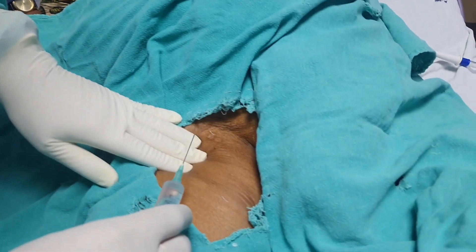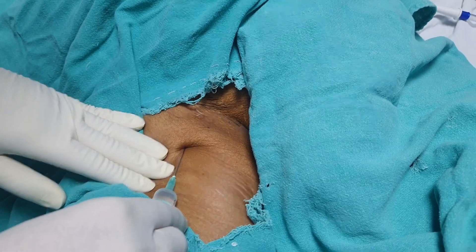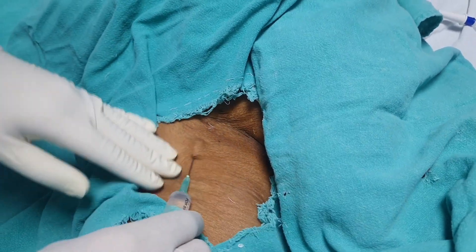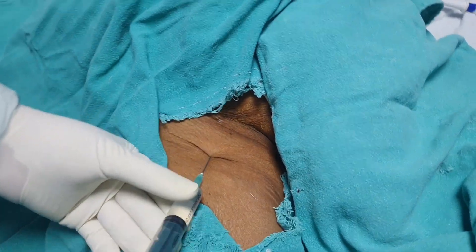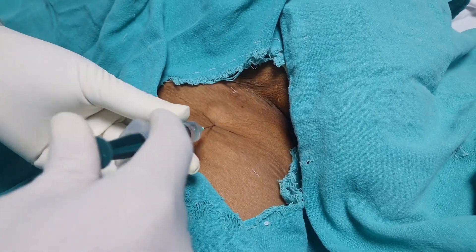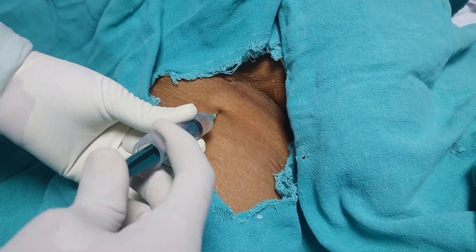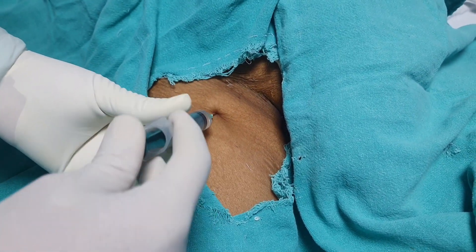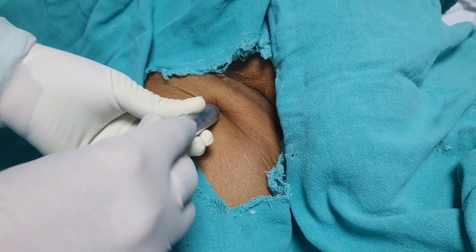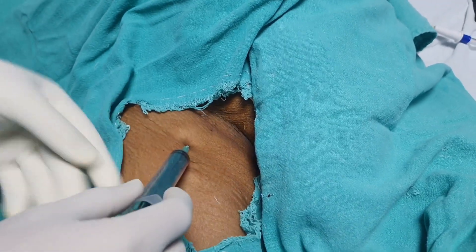We will start the procedure by giving local anesthesia with 1% xylocaine. We will take 3 to 4 ml of 1% xylocaine and inject into the skin, subcutaneous tissue, and muscle plane, giving negative pressure to check whether blood is coming or not.